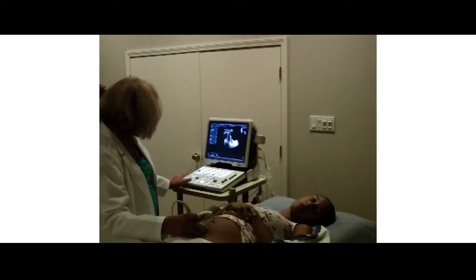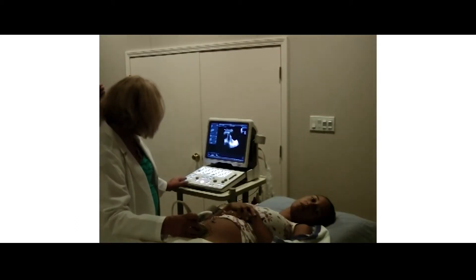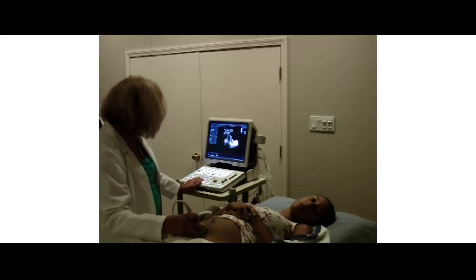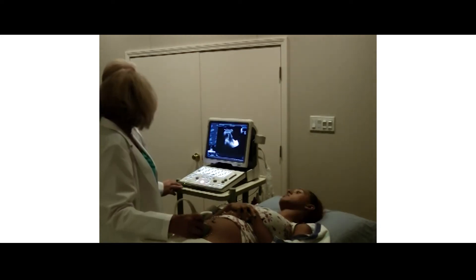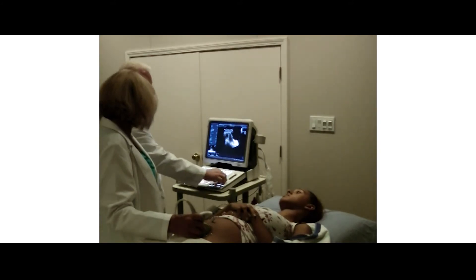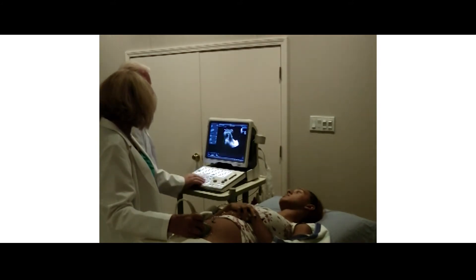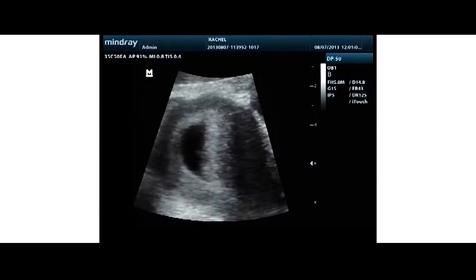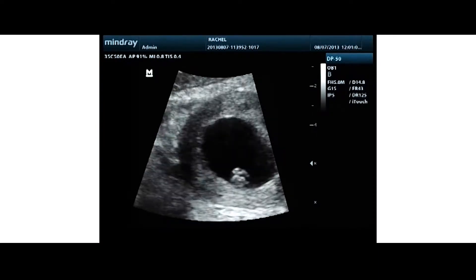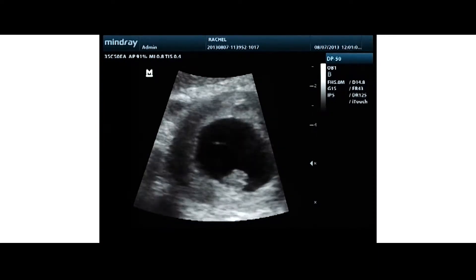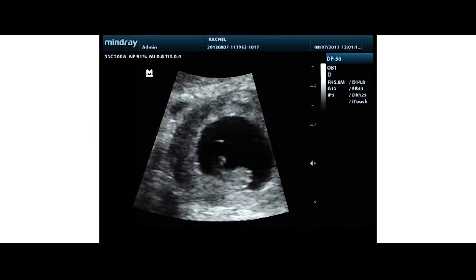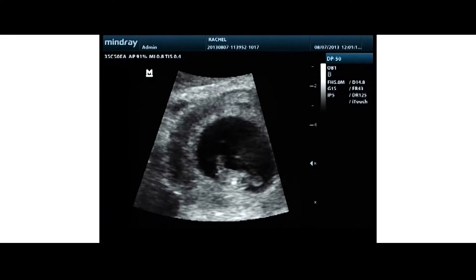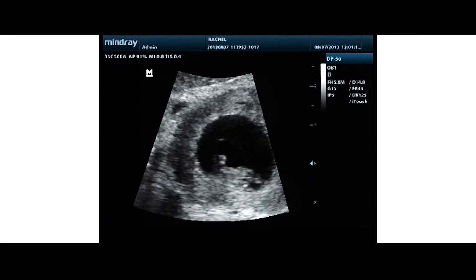We can see we have an intrauterine pregnancy and there's a gestational sac right there. At this point you want to zoom it up a little bit — we bring that whole area right up into play. You can see good cardiac activity.